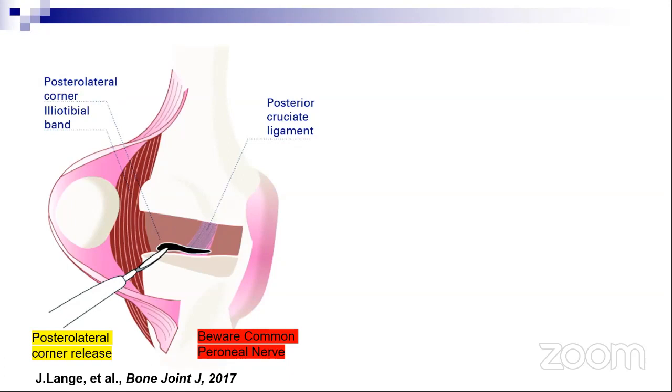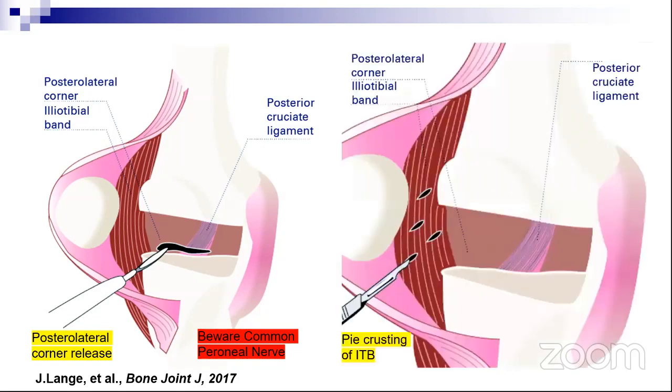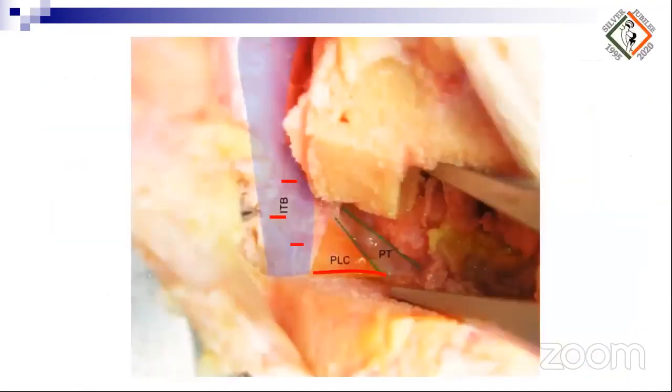With your diathermy, you do a posterolateral corner release. Followed by this, you do multiple stabs with a 15 blade. And this has to be in a graded fashion, as Anup just showed. You don't do 4, 5, 6 stabs in one go. You do 1 or 2, and then you check. If it's not opened up, you do again 1 or 2 and check. If you've given too much, then you would end up with laxity. And this is what it looks like during the surgery.